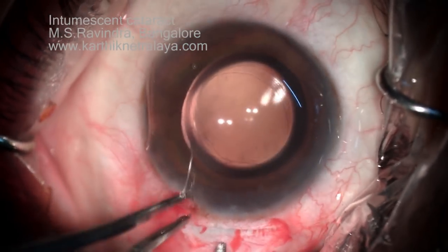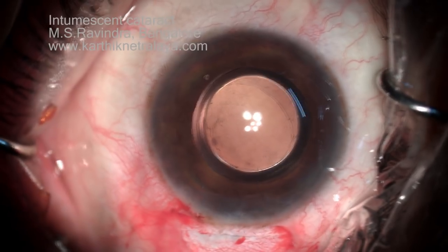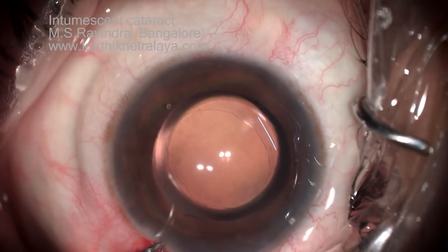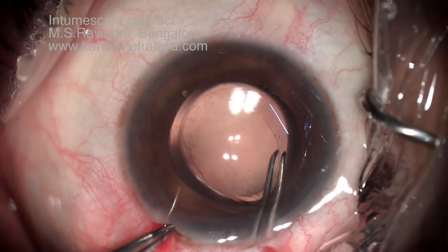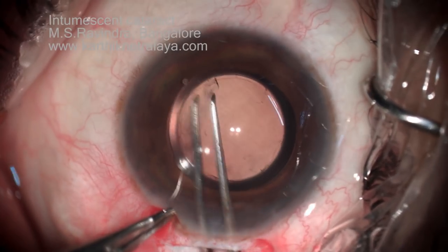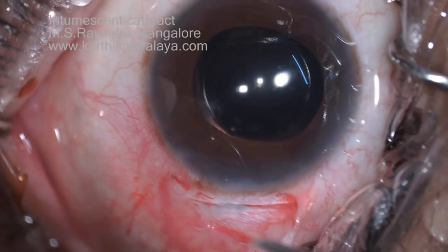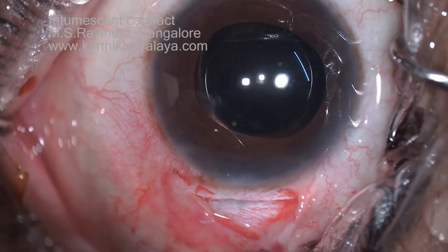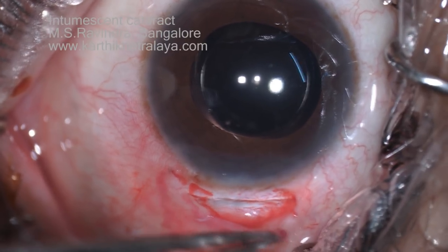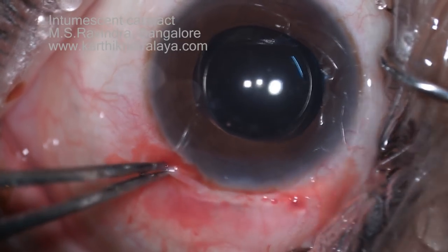A little more viscoelastic is injected to enlarge the rhexis on one side where it is overlapping much more than the other side. A small nick is made, viscoelastic is injected again, and the nick is run around so that the chance of phimosis late in the postoperative period is avoided. That's an adequate-sized rhexis now, overlapping on the edge of the lens. Remove the viscoelastic from every part of the eye — that will be the end of surgery. Fibrin glue is applied so that the conjunctiva is co-opted and at the end of surgery there is no need for a bandage. The eye is completely sealed with no openings. Thank you.